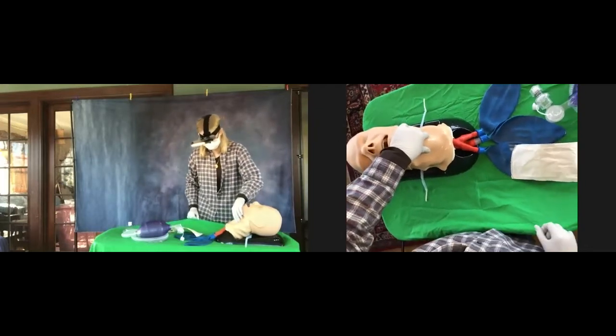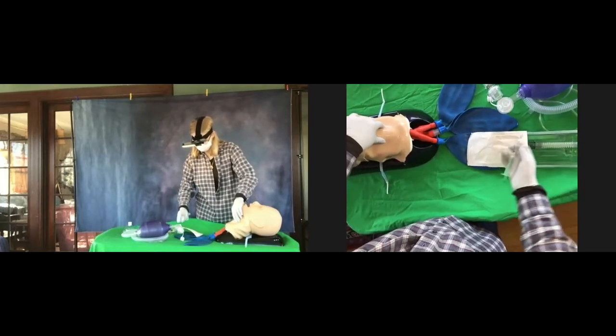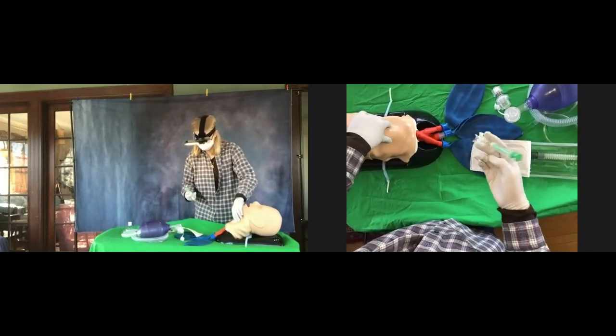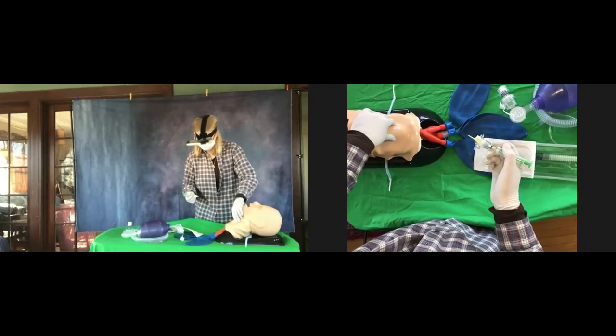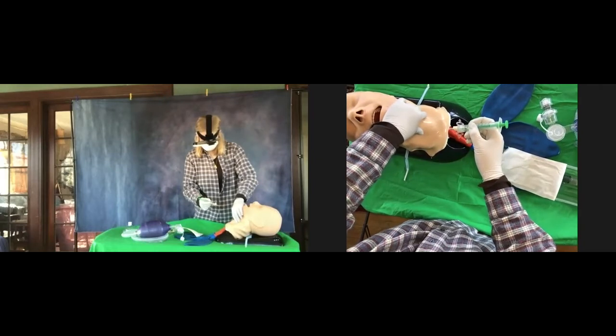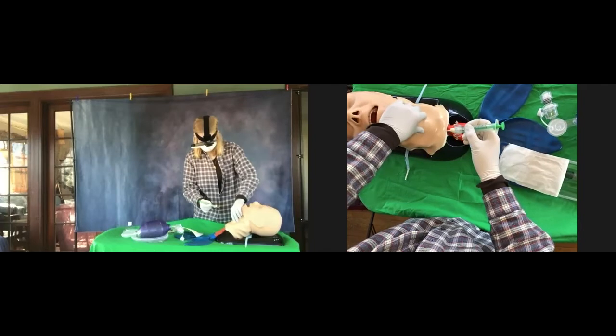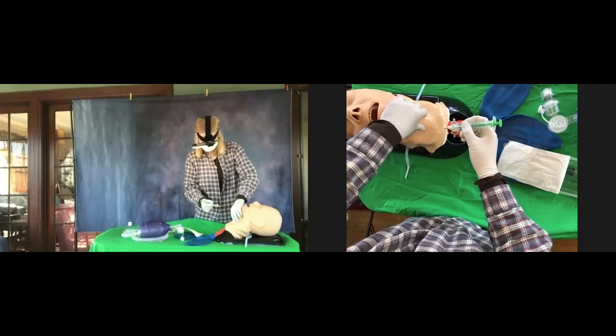Now take the QuickTrach and lift it up. With the curve pointed towards the patient's feet, you're going to enter the skin right in that soft spot at about 90 degrees and advance about two or three millimeters until it's in the skin.